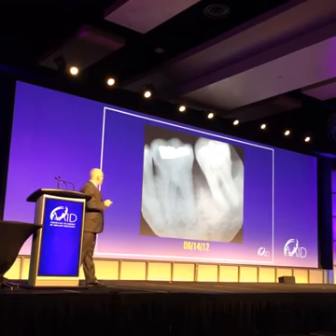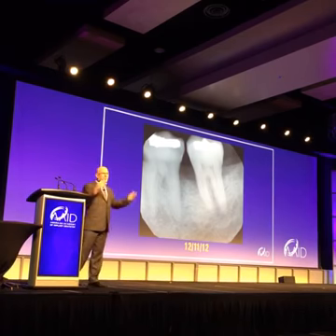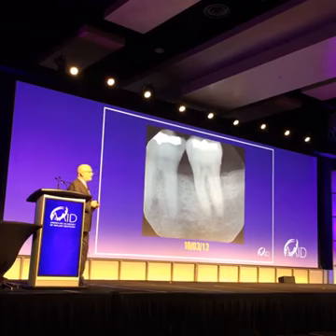So we went ahead and treated him. 6 months later, that's what we have. Don't forget, it's 1 treatment. There's no exogenous bone graft in there. And then a year later, you can see here, the bone's pretty much come back.